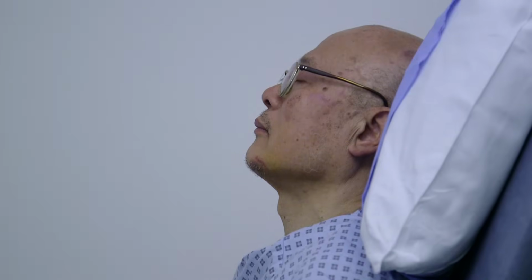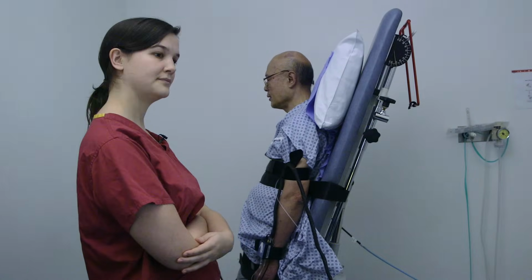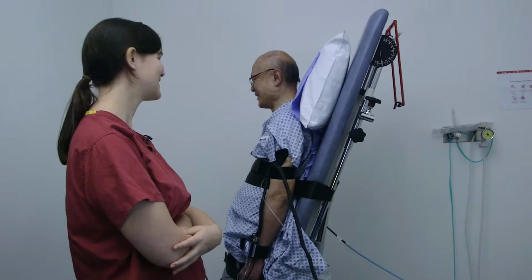Fantastic. Sometimes we encourage people to carry on with the test, even if they're getting some symptoms, if we feel that we haven't got enough answers in terms of blood pressure and heart rate to give an answer to what may be causing the symptoms. Any dizziness? No. Am I supposed to pass out? No. You just tell us how you're feeling. But the patient's always in control. If they want to stop because they've had enough, then that's always fine.